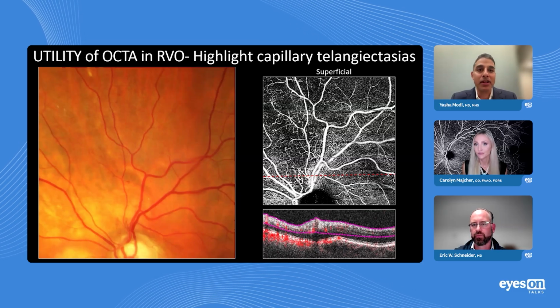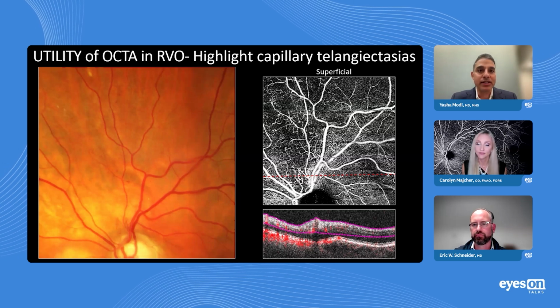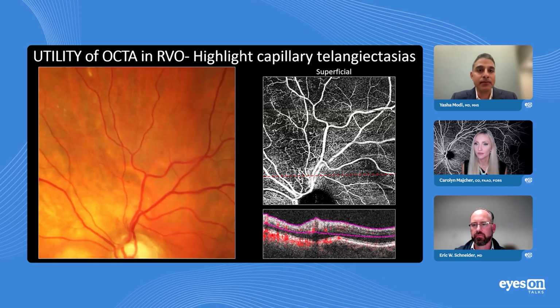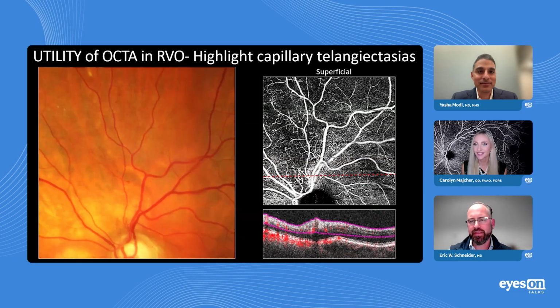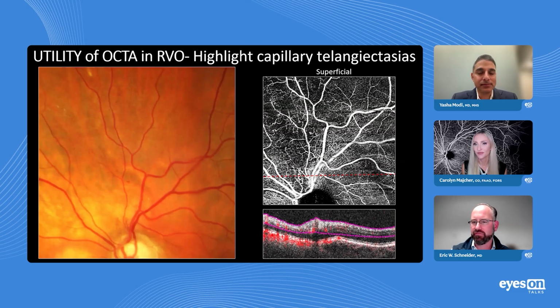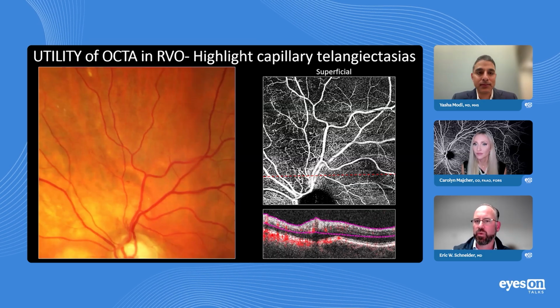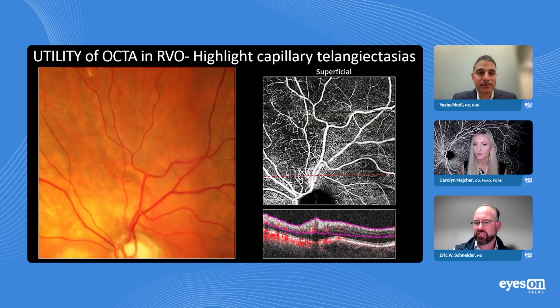First of all, I love the fact that you used OCTA, but Eric, in your practice, is this something where maybe the role of FA is diminished and you're really just trying to get OCTA imaging over this? Yeah, great question, Yasha. I think in this situation when there's a relatively mild finding, I don't think intervention is probably going to be necessary. I think OCTA is perfect, right? In this case, it's non-invasive, it's quick. I don't have to subject the patient to an invasive needle stick.